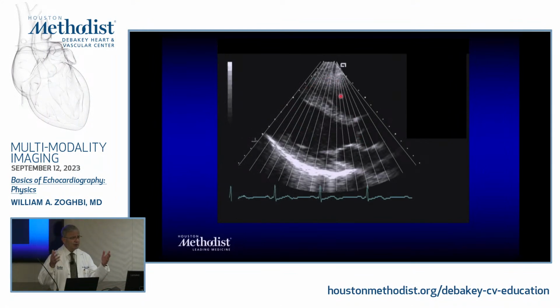You're not seeing them. In the old days, we used to see a little bit of that. You don't see them because of smoothing. Notice another thing: since the scan lines are emanating from a single area, the distance between them is a little wider the further you go out, and therefore your resolution is not going to be as good in the far distant field.